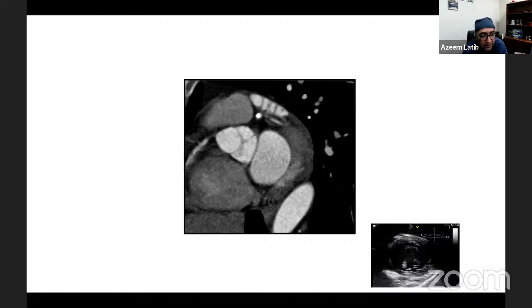Thank you so much. Once again, it just shows how simplistic our thinking often is about this, right? And about transeptal puncture, because one of the take-home messages I take as well, I do transeptals all the time, is how there's so much variability. And with CT scans, having a CAT scan before, you can really tailor the puncture for that patient's anatomy.